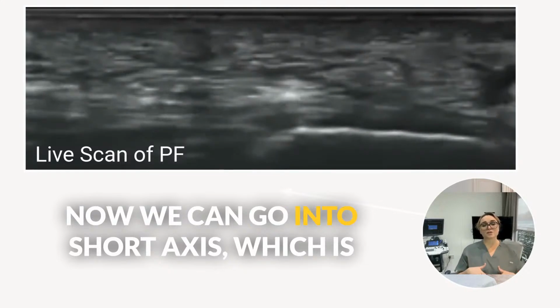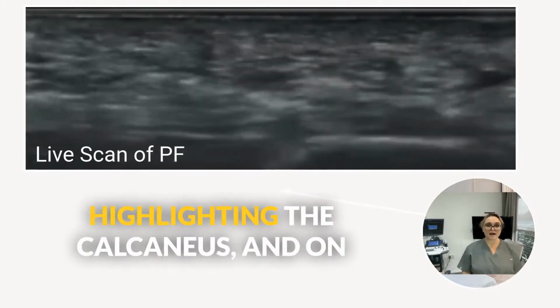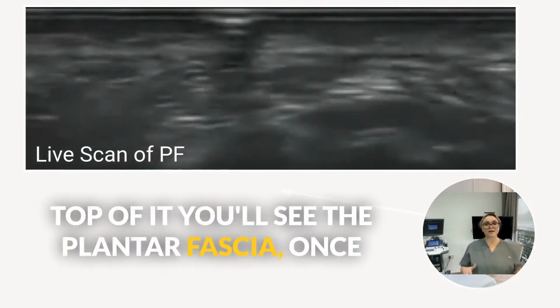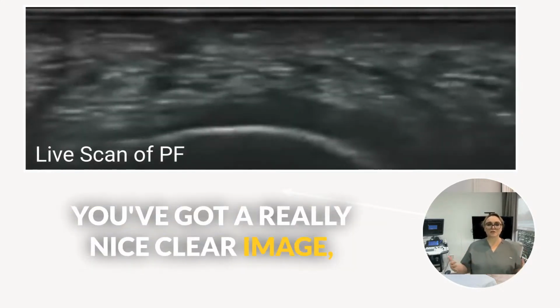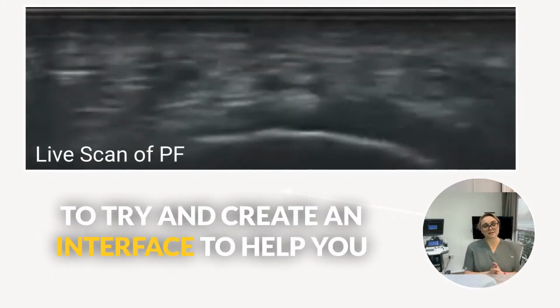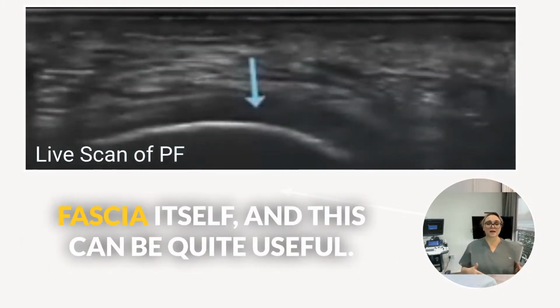Now we can go into short axis, which is a little bit trickier in some ways to see, highlighting that calcaneus, and on top of it you'll see the plantar fascia. Once you've got a really nice clear image, you can palpate the subcutaneous fat layer to try and create an interface to help you see the difference between the tissue layers, between the fat pad and the plantar fascia itself.